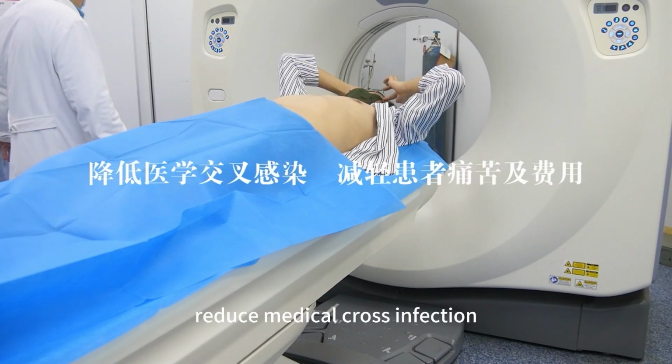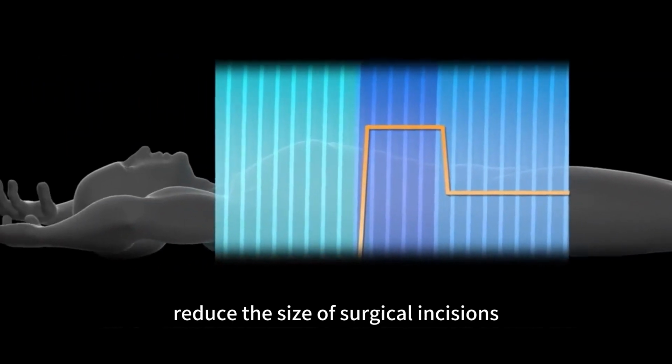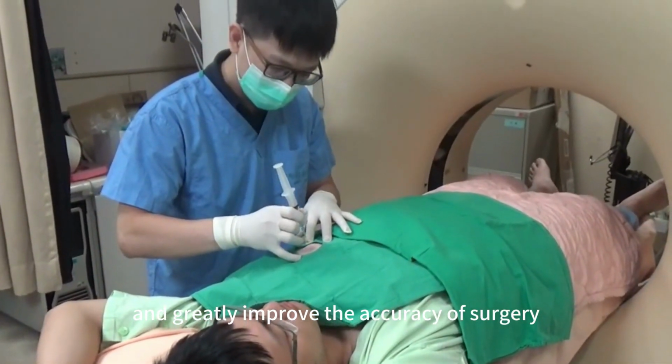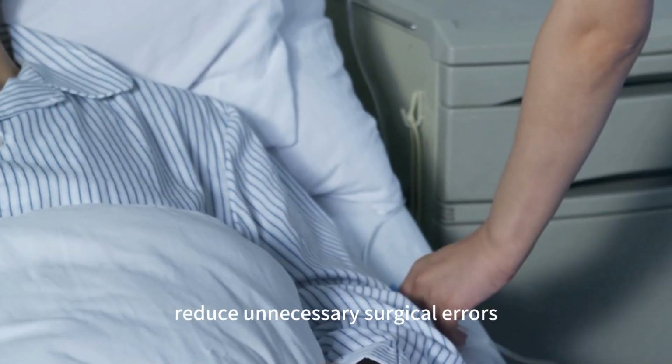1. Reduce medical cross-infection. Reduce patient pain and costs. Reduce the size of surgical incisions and greatly improve the accuracy of surgery. Reduce unnecessary punctures. Reduce unnecessary surgical errors.